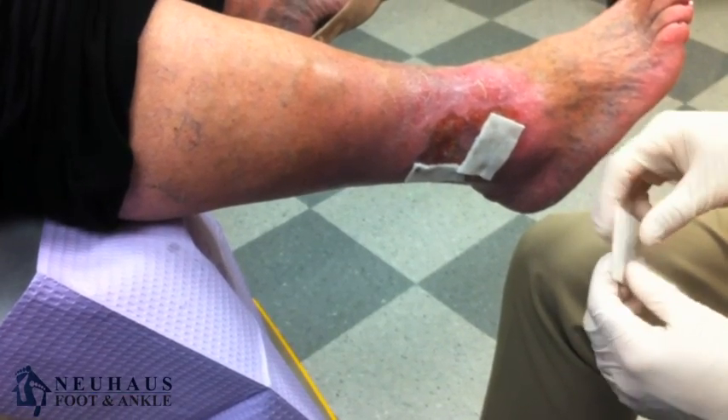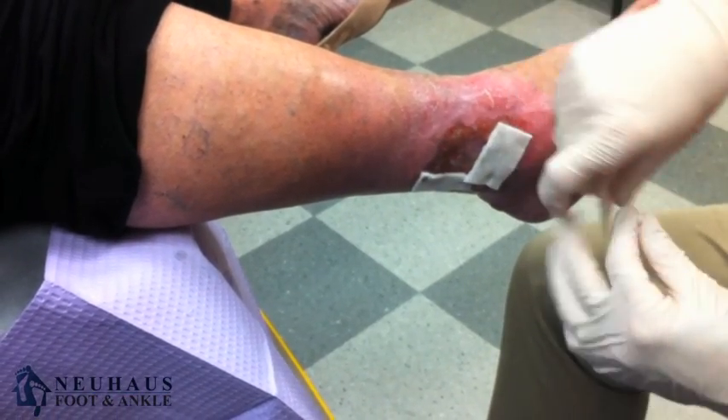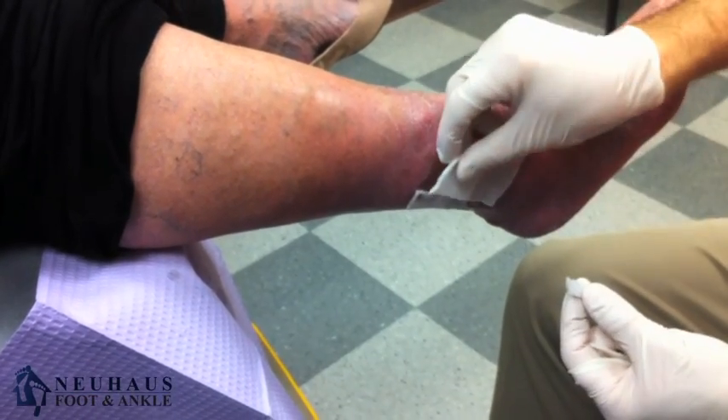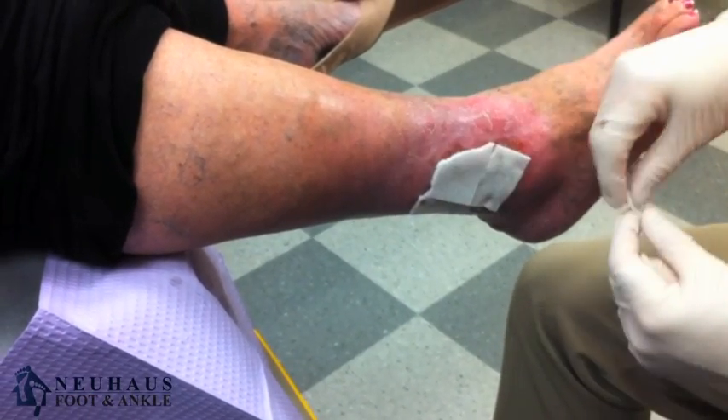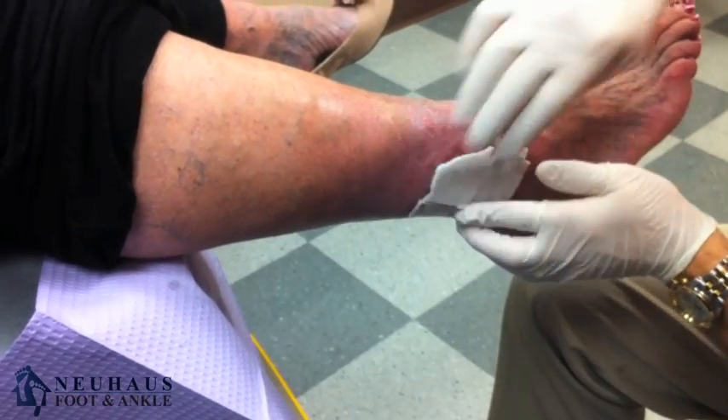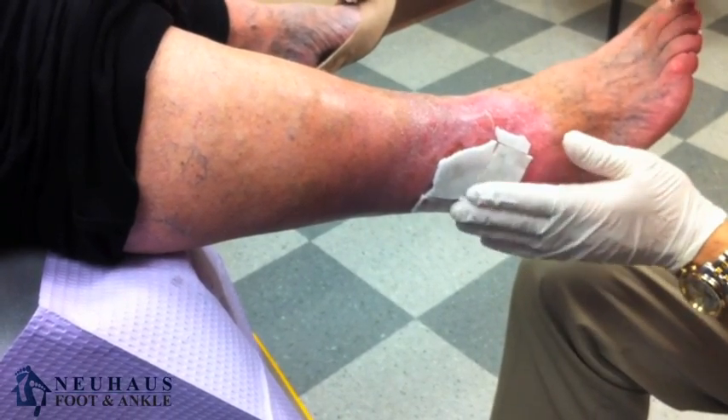What I'm going to do today is use a bandage. This is actually called Fibrocol that I'm putting on. You can see that I tear it — it's like a foam dressing that absorbs a lot of drainage. These wounds tend to drain a lot, so I'll put this on there to help absorb the drainage.